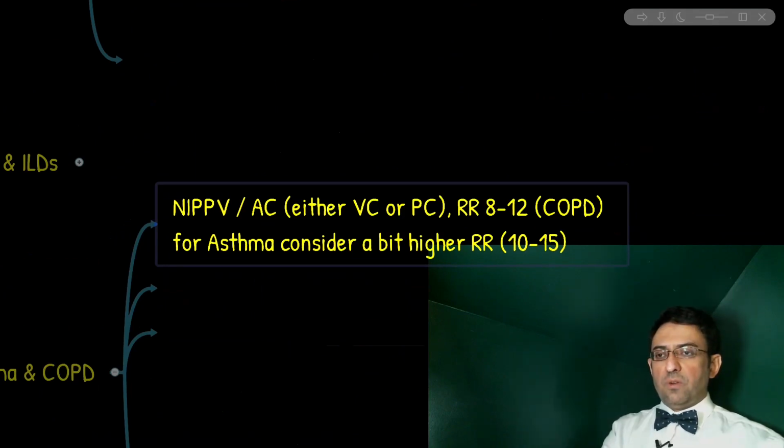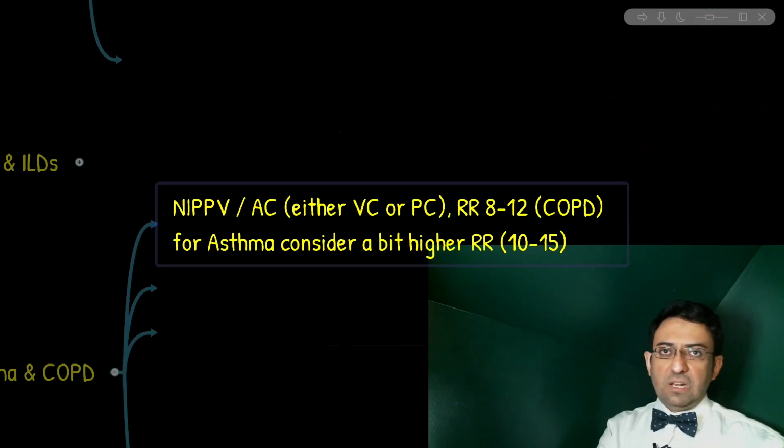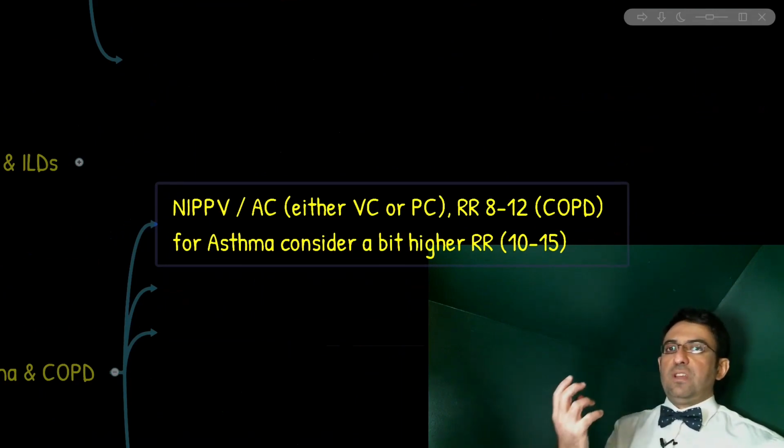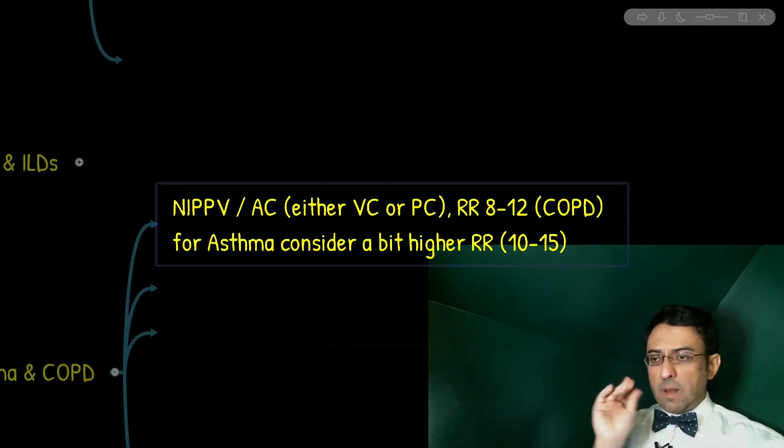And so therefore, we focus mainly on a separate index, and that is the I to E ratio. You remember we mentioned the inspiratory time to expiratory time ratio is usually 1 to 2. In acute exacerbation of COPD, we want to provide a means of ventilation to the patient that not only provides enough oxygenation, but also enough time to exhale.